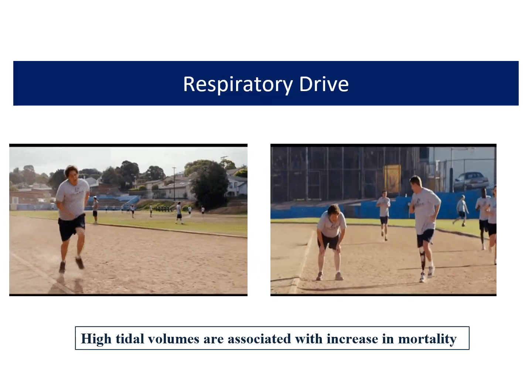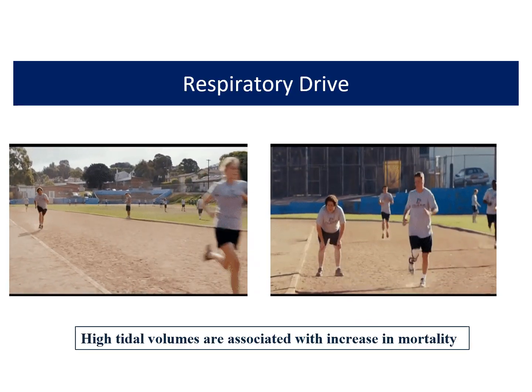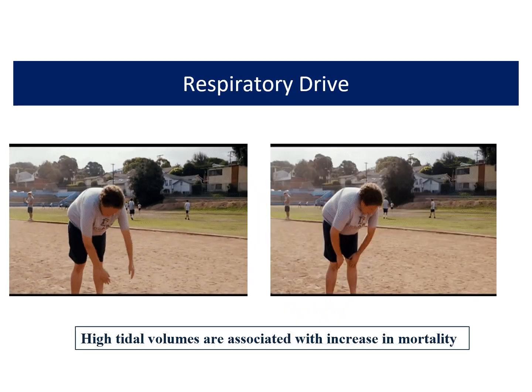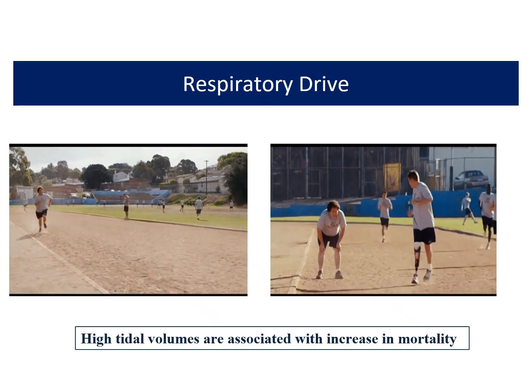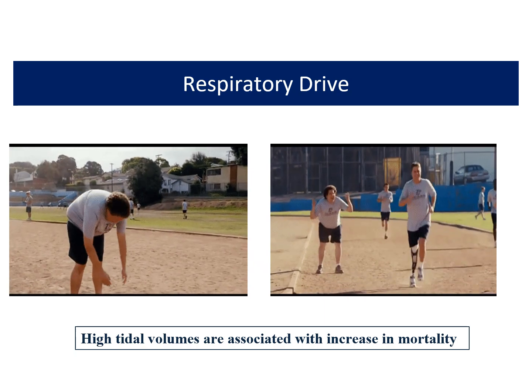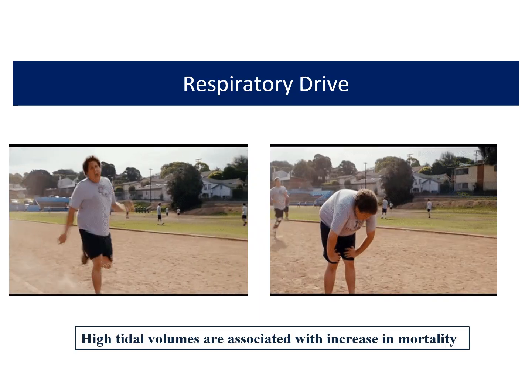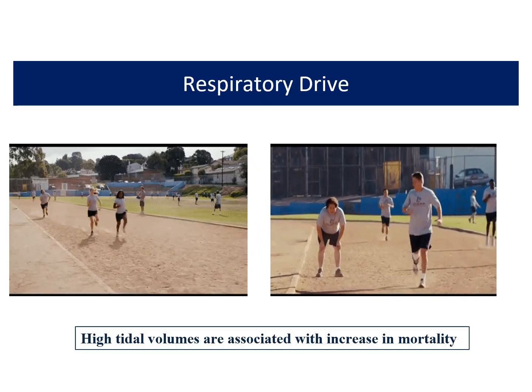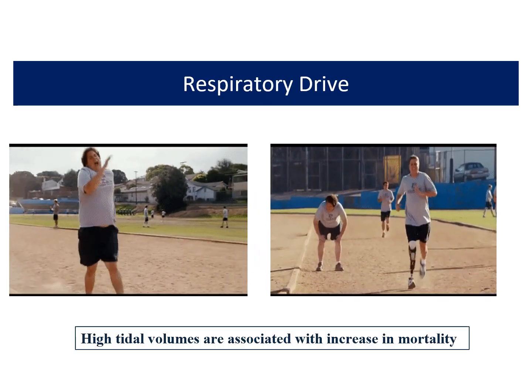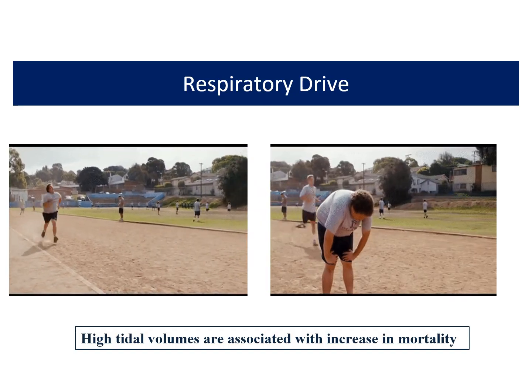6 ml per kg ideal body weight, but sometimes the respiratory drive can be seriously high, especially in patients who are also having acidosis, where you have to take control of the ventilation. So those are the patients where you'll require a deep sedation, which we don't want to do, but sometimes you have to do a deep sedation. And sometimes in these patients you might require a neuromuscular blockade, especially in the first 48 hours of a severe ARDS patient. We always ensure that the patient is deeply sedated to a RASS score of at least -4 before giving neuromuscular agents, right?